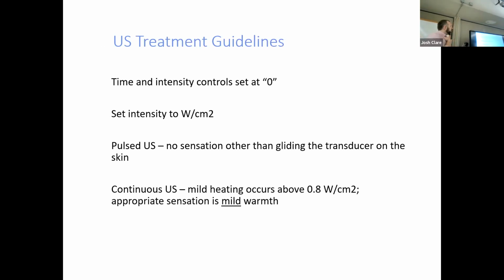So some guidelines: set the time and intensity controls to 0, set your watts per centimeter squared, then you can start turning it up. Some machines have different settings too. We'll have to play with that. Again, you can practice moving the sound head and operating the buttons without the machine on, to get used to that kind of mechanical process.